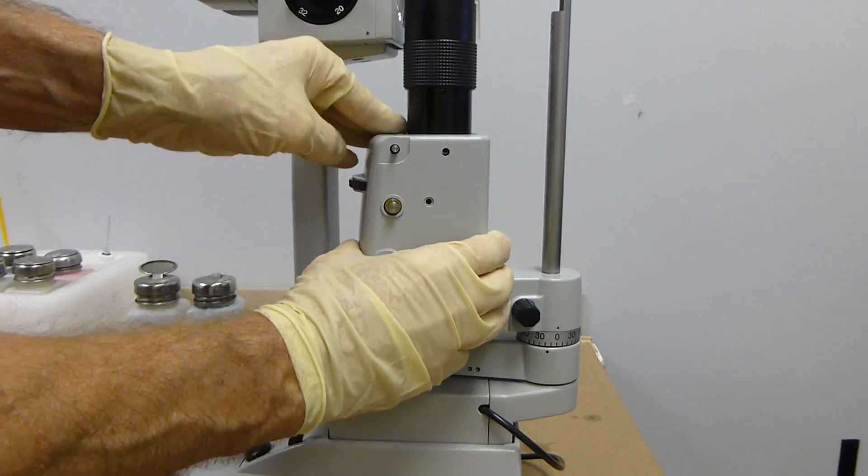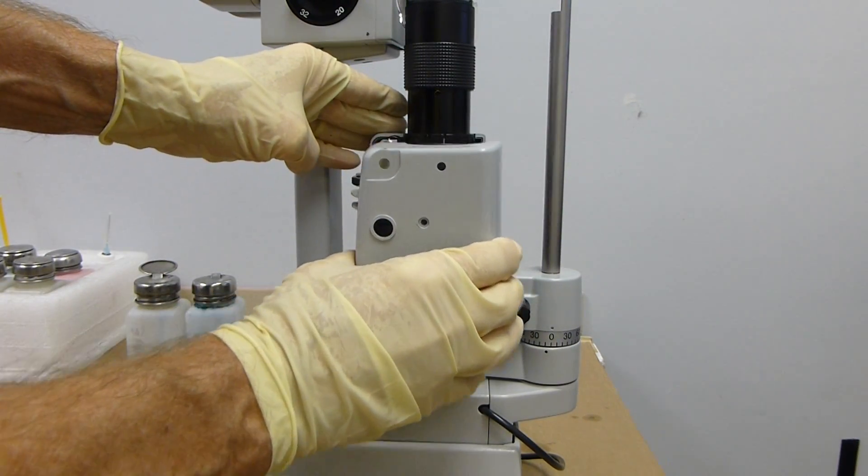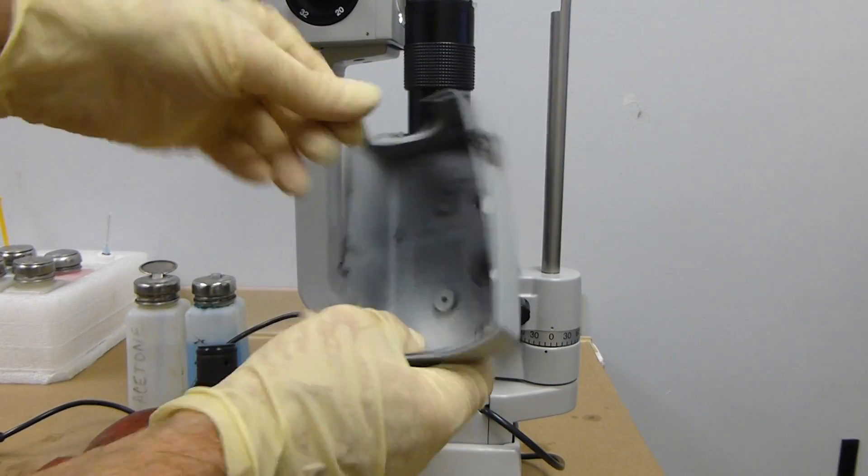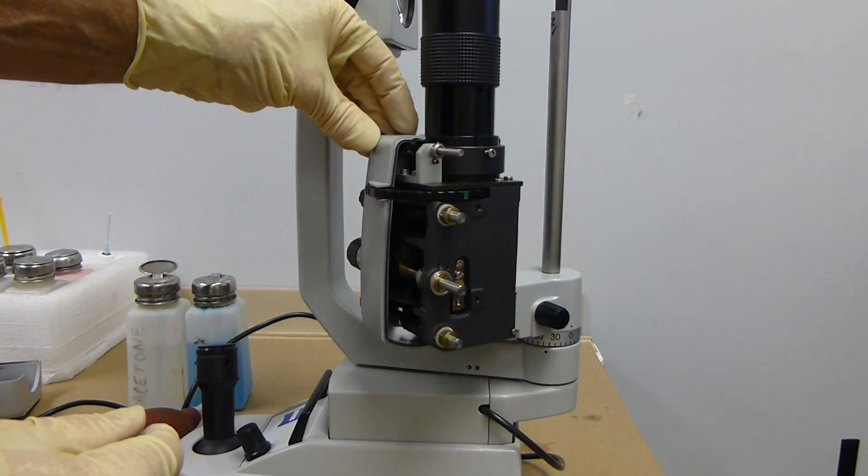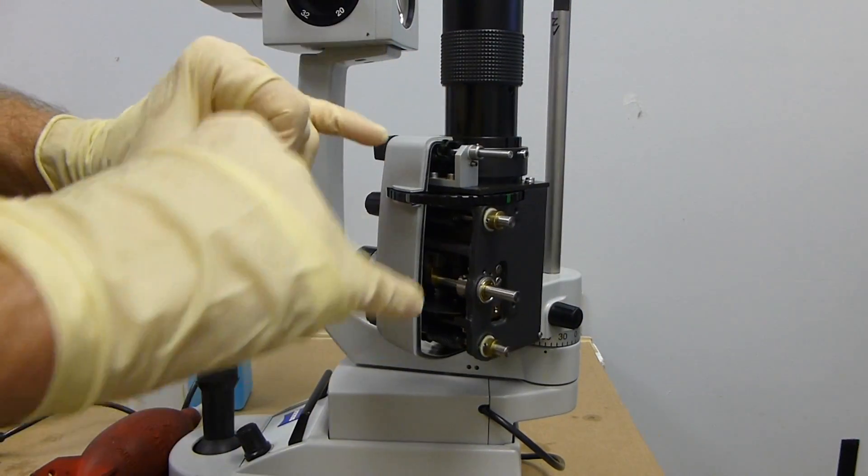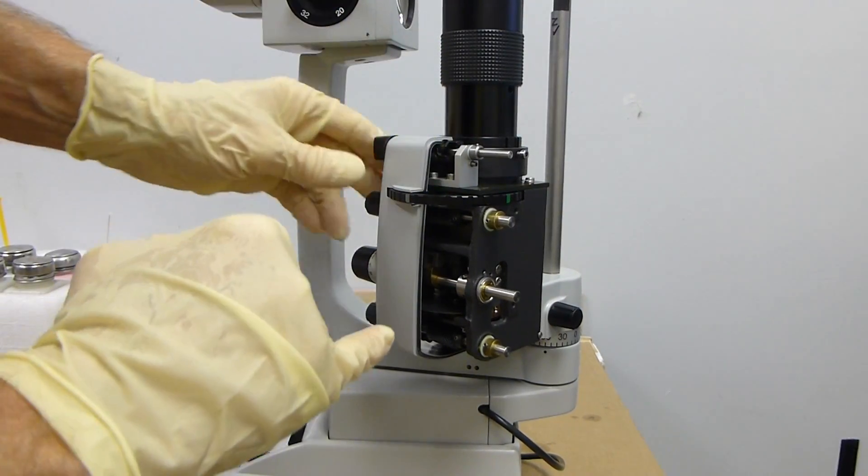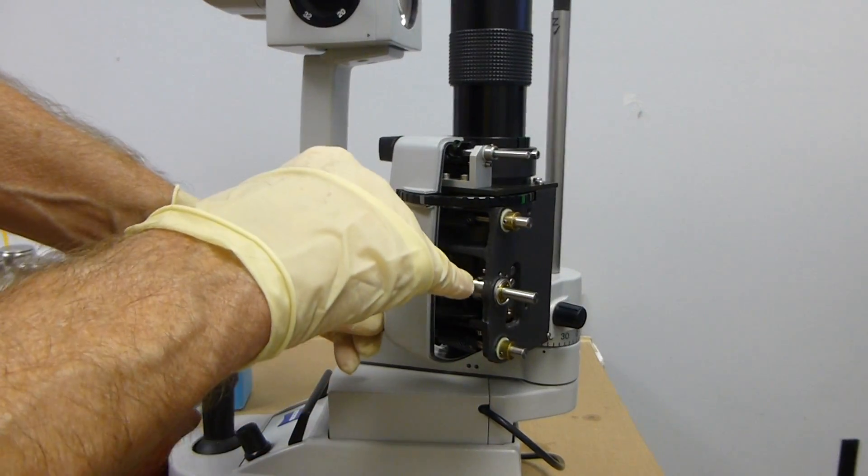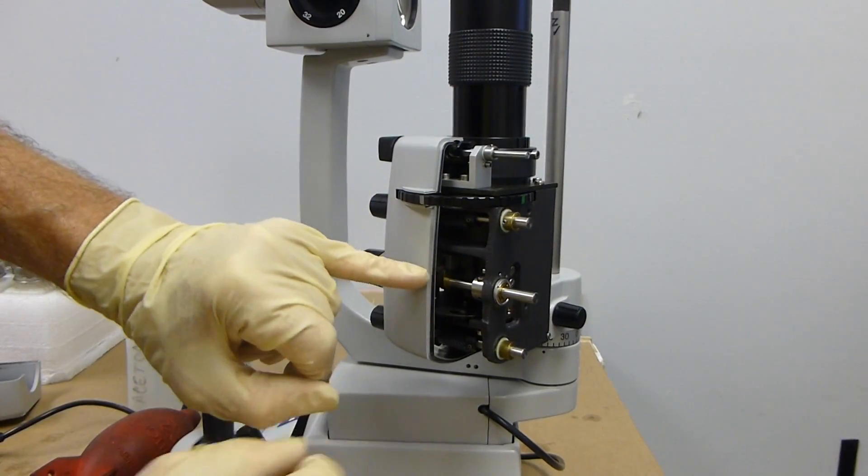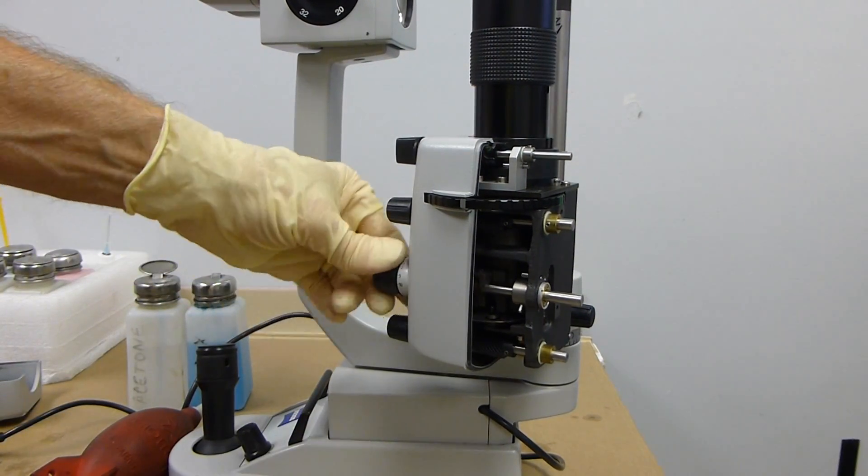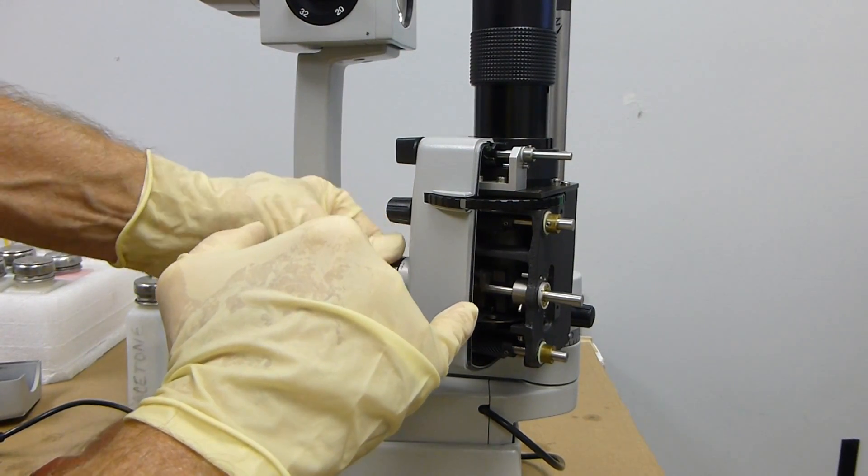Once you have your two Allens off, this side panel should come off. You have a little bit greater access to your filters. Here's your diaphragm right here, and then inside are your slits. When you turn your slit adjustment knob, you can see the slits in there.